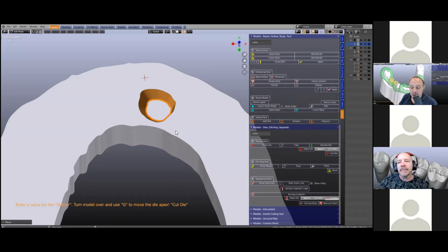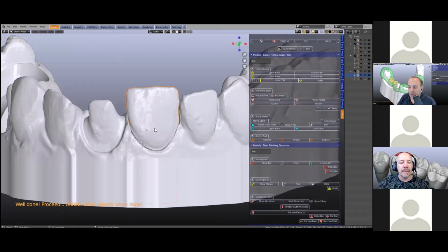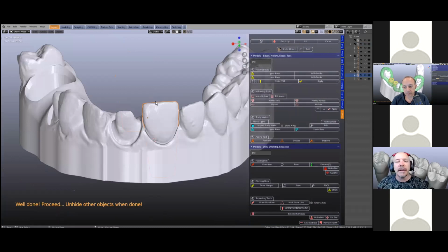Some people have asked if it can be used for minor orthodontic work, Michael. Can you elaborate? Well, it can, but from our side, no, we're not going to go away from our modules, because you can imagine we'll be inundated with, how do we do this? How do we do that? And so we stick strictly within the scope and confines of our modules. Anything outside of that you can do, but it's your baby to do. Okay, all good.